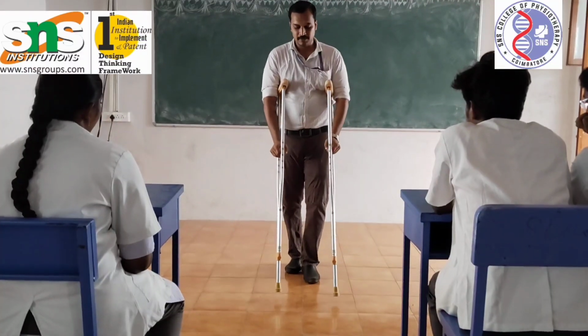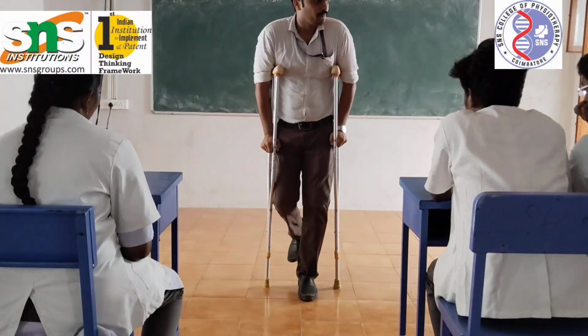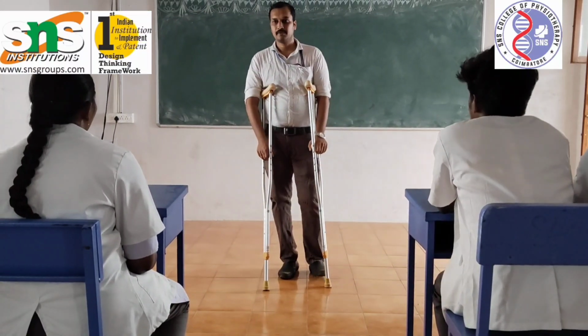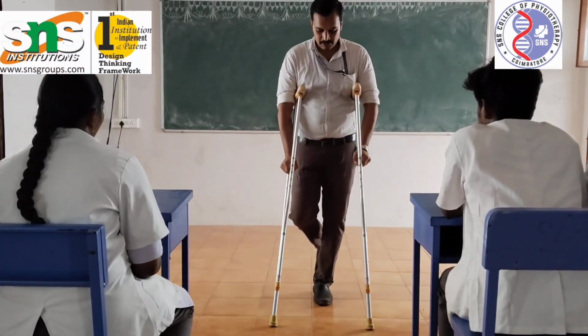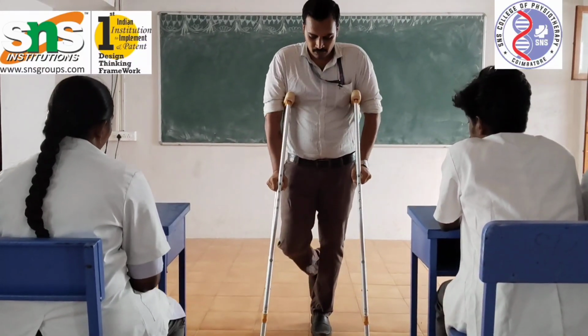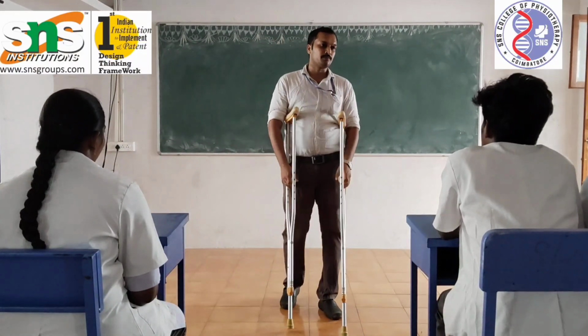If we teach the patient to cross the line, it is swing through. Which one is the danger of fall? Swing through is the danger of fall. So initially we teach only swing to. Once the patient has fully mastered swing to, then we can teach the patient swing through. This is the progression from swing to to swing through.